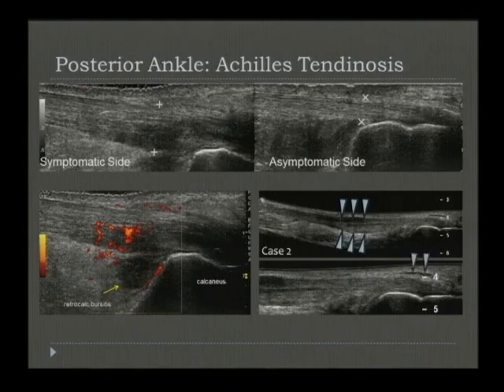In addition, this patient had distension of another bursa, the retroachilles bursa. Now, this should never be seen on ultrasound. It is not a normal finding. So if we see it, you can call a retroachilles bursitis. This is usually secondary to poor footwear.